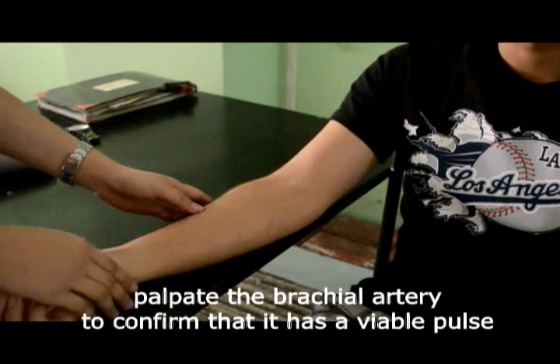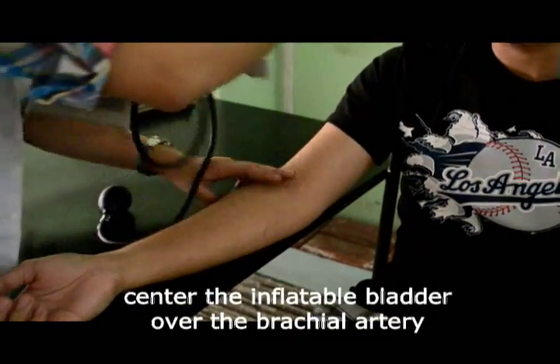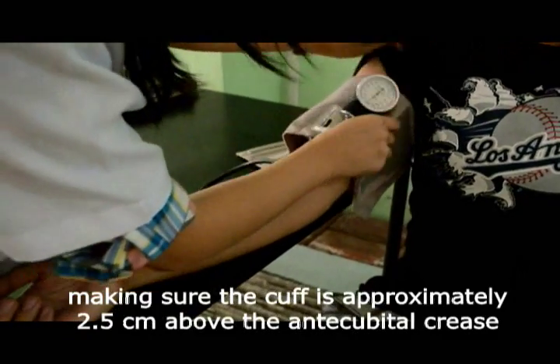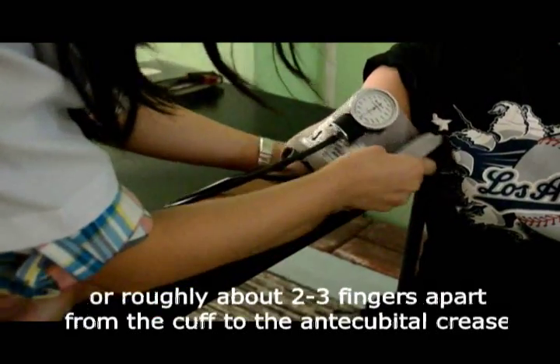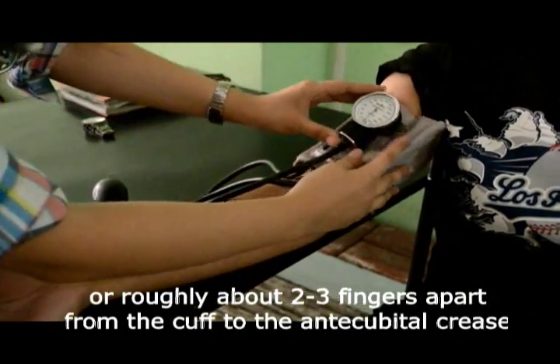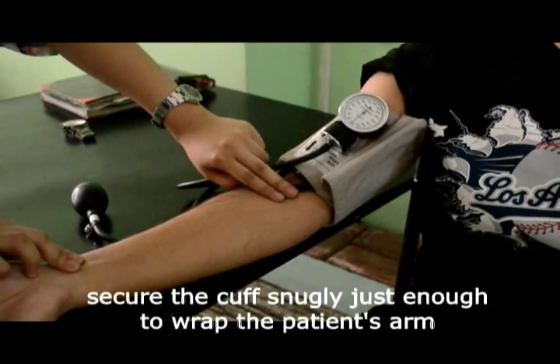Palpate the brachial artery to confirm that it has a viable pulse. Center the inflatable bladder over the brachial artery, making sure that the cuff is approximately 2.5 cm above the antecubital crease, or roughly about 2–3 fingers apart from the cuff to the antecubital crease. Secure the cuff snugly just enough to wrap the patient's arm.